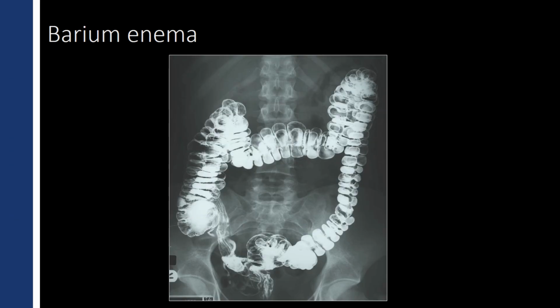All right, so if the patient didn't like his upper GI and small bowel follow through, he's certainly not going to like the way we evaluate the colon. You can't really do a good antegrade study of the colon because you can't dilate or distend the colon well enough. And so we do this retrograde. We put a catheter into the rectum, we blow up a balloon within the rectum to hold that catheter in place, and then we infuse barium through the catheter.